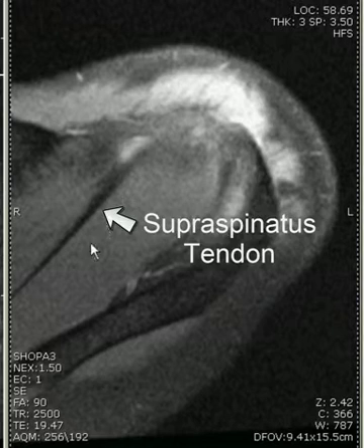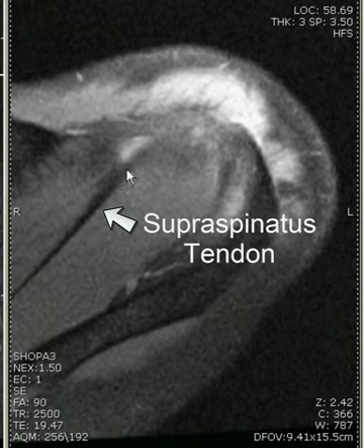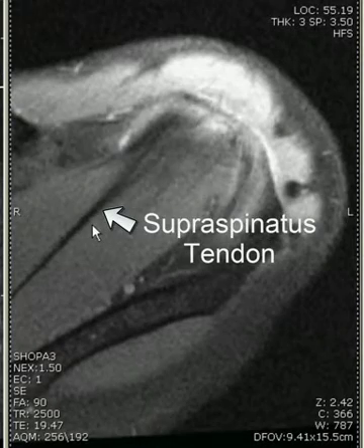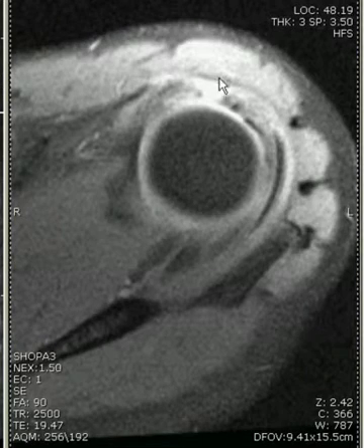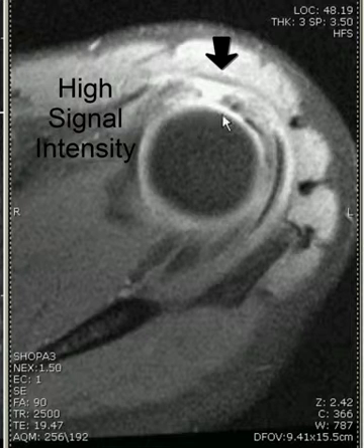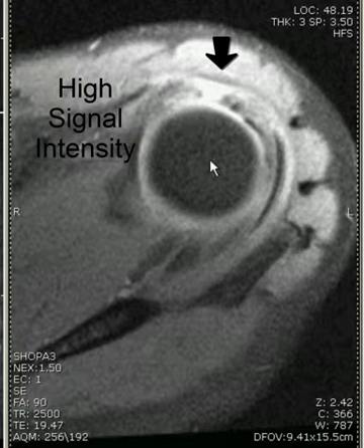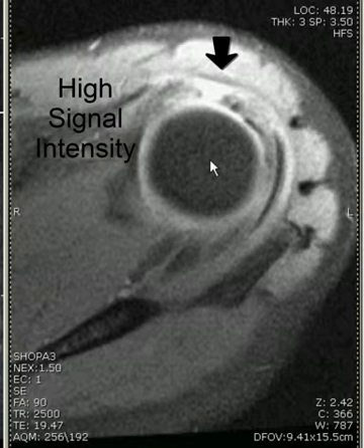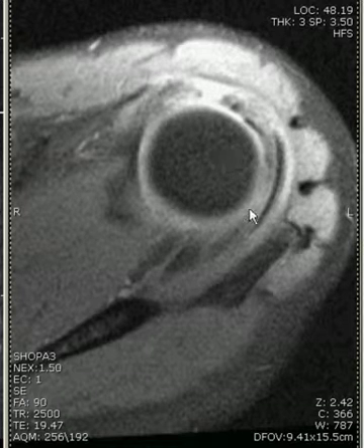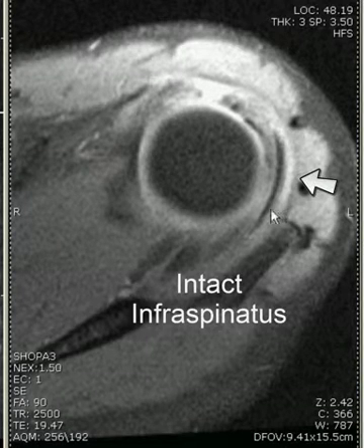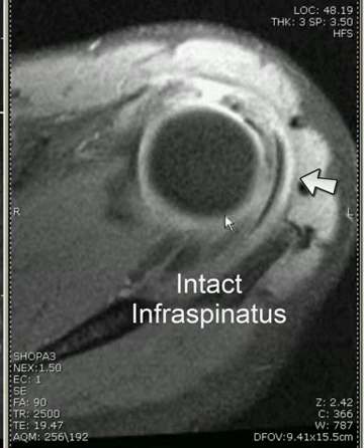As we move more inferiorly, we can see the supraspinatus tendon, and more inferiorly, we can see a focal area of high signal intensity within the supraspinatus, extending through its entire width in this area. Notice the intact infraspinatus.